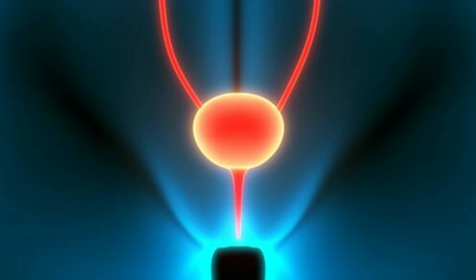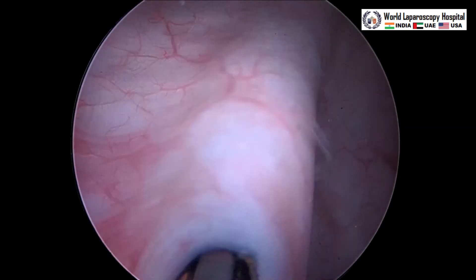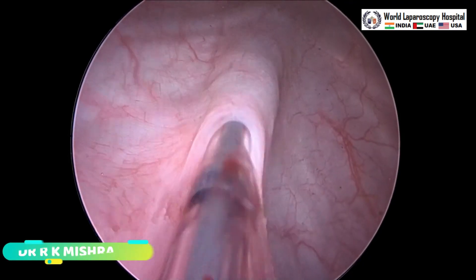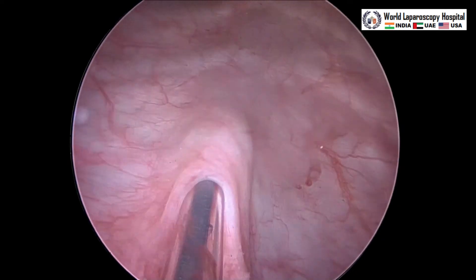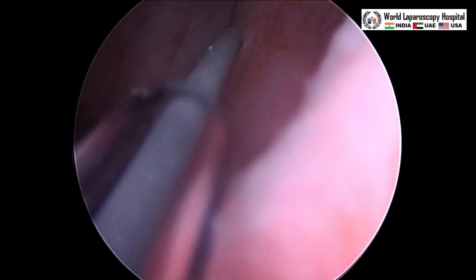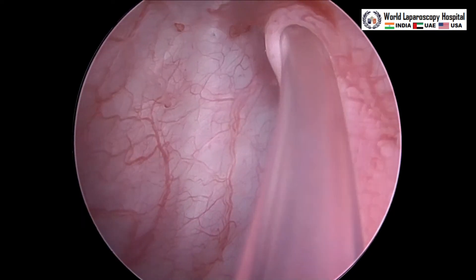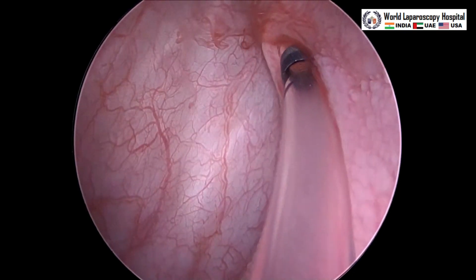Now let us see how to do the infrared ureteric catheter. The infrared ureteric catheter is introduced with the U-kit — Stryker makes it by the name of U-kit — and it is a transparent ureteric catheter with a guide wire. This is introduced into the right ureteric orifice. There are two thick markings at 10cm and three thick markings at 15cm. After reaching 15cm, take the guide wire out and then take the cystoscope out. Now introduce on the left side — always remember the soft end of the guide wire should go in first, otherwise the ureter will perforate. Count every centimeter marking until 15cm, then take the cystoscope out.